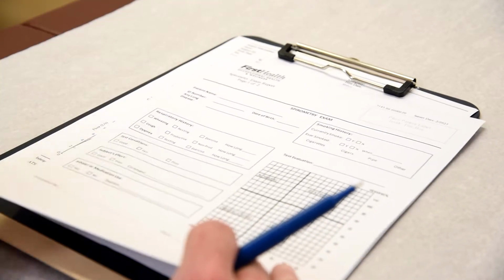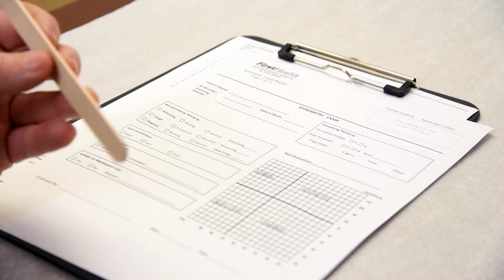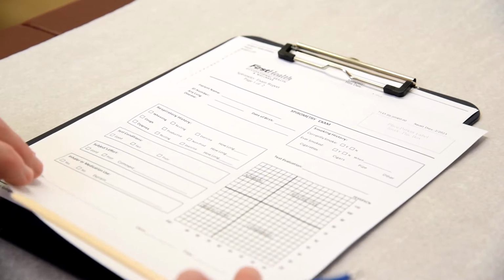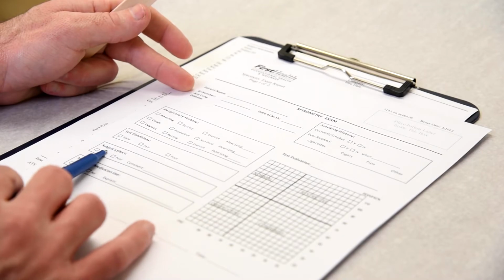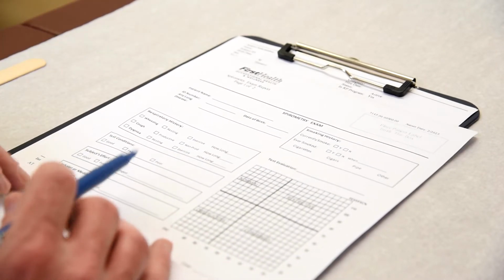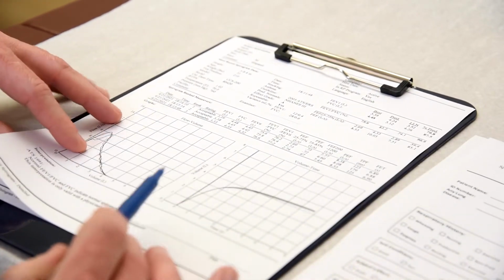I like to use my handy dandy ruler, which is a tongue depressor. I think we'll find it in every clinic. Sometimes it's hard to find a ruler. First of all, I just want to point out that you'll notice on this form you'll have these different questions here. This may or may not be completed in your clinic, and the reason for this is because on the printout all of that information is there for you.